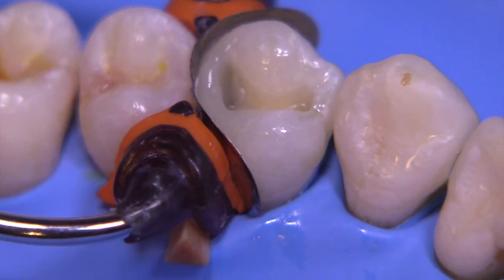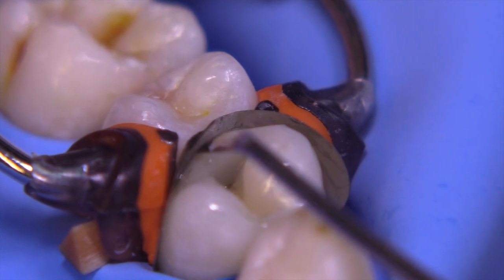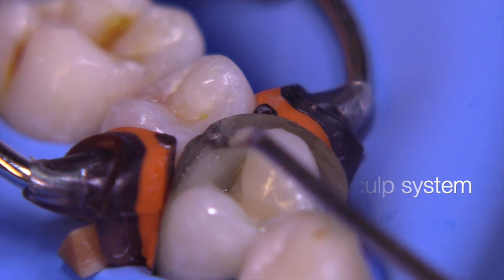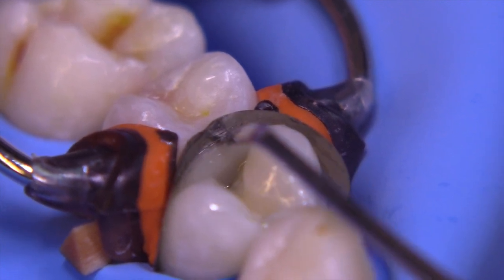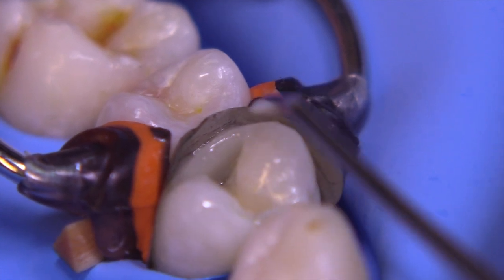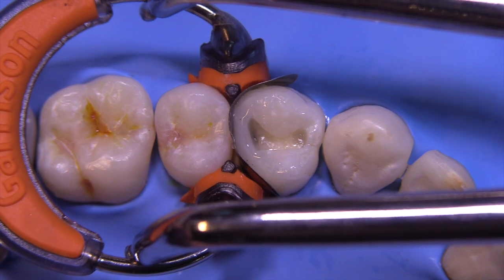Another important step is to use the IPC to push the composite back away from the band near the adjacent tooth so that you create an occlusal embrasure. We'll go ahead and light cure for the appropriate amount of time, and at this point we're going to remove the ring, matrix band, and wedge assembly.